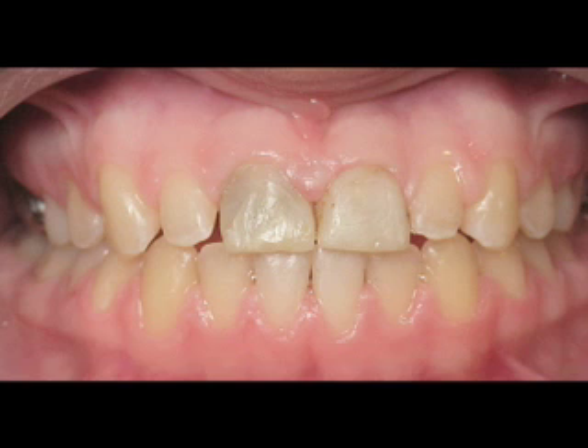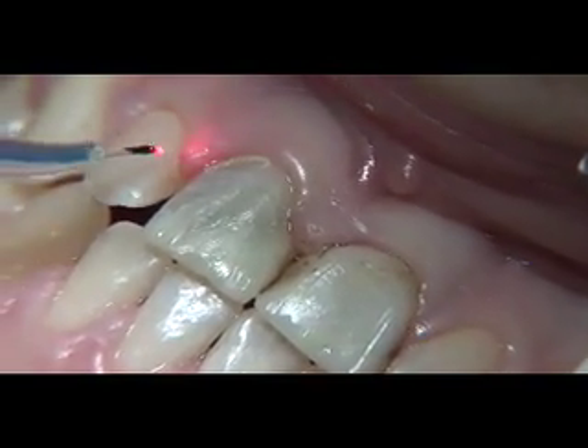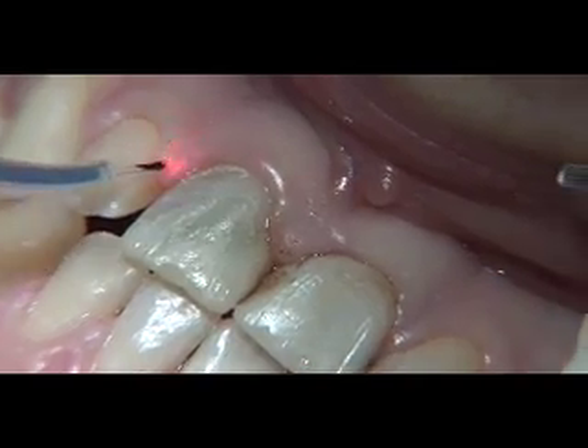Here is a post-ortho case — a 15-year-old female who was very unhappy about the way her teeth looked after she was de-banded. Root canal treatment with large metal posts on teeth number eight and nine made lava restorations a better choice over empress veneers due to the deep discoloration.